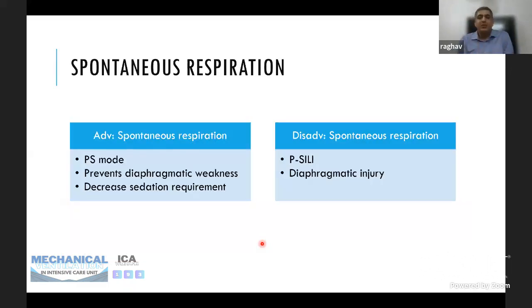So as soon as our patient with ARDS shows some improvement after controlled ventilation of 1 or 2 days, which is usually seen after 2 to 3 days, you should try giving a spontaneous respiration trial to the patient. The paralysis should be stopped, and he should be given the opportunity to breathe either with a SIMV mode, assist control mode, or pressure support mode.